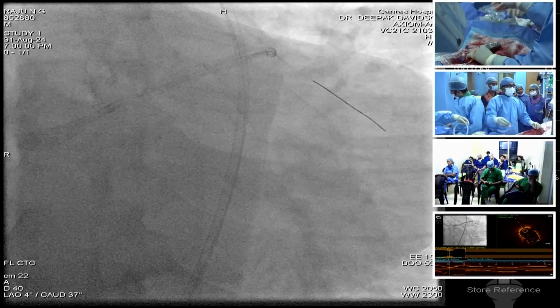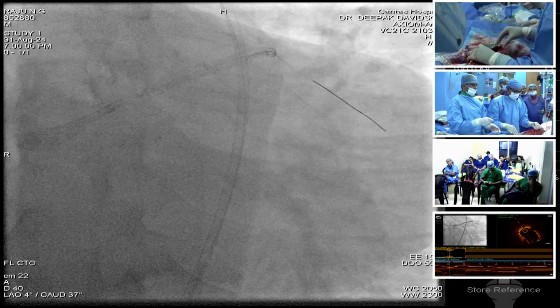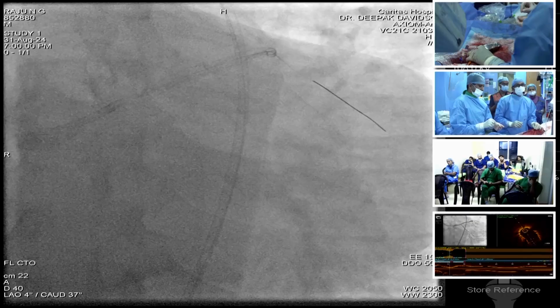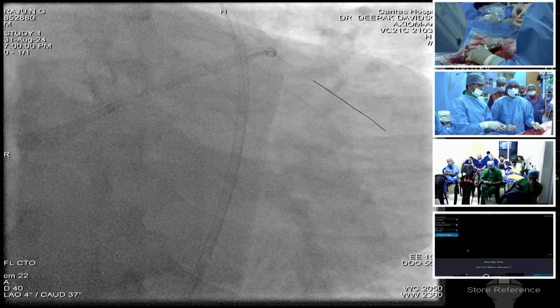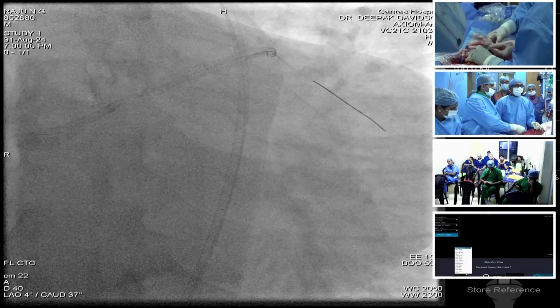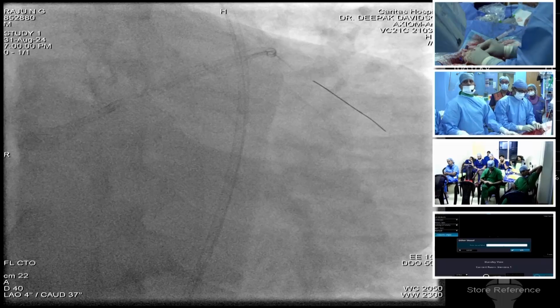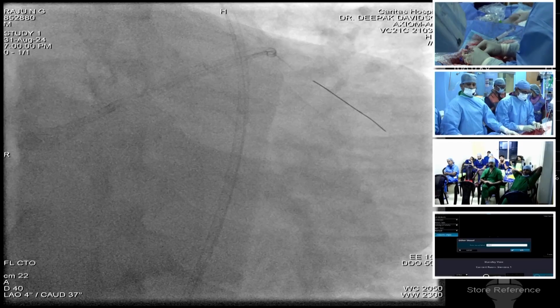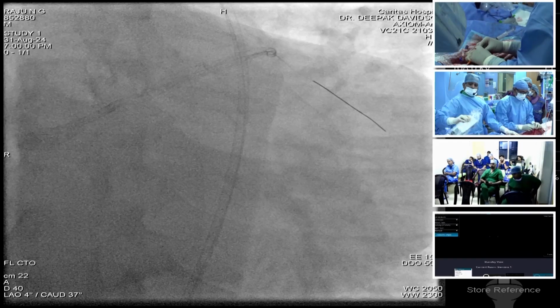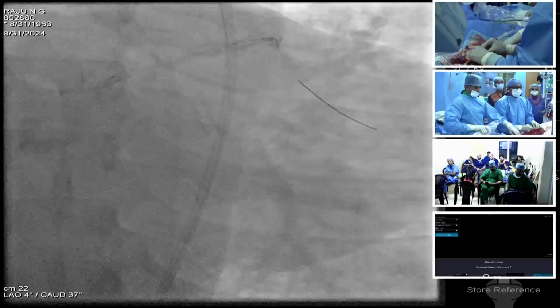To look at the ostium of left main, do we need to use that Nipro catheter as a transparent catheter? No, Nipro is not transparent, only the telescope. Yes, telescope, that you can see only the most distal 2 millimeters. That 2 millimeters alone is transparent, but it doesn't make a huge difference. We'll pull back the guide catheter and position right at the ostium and see that.